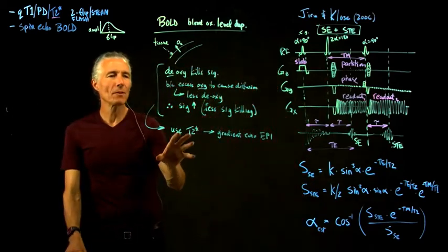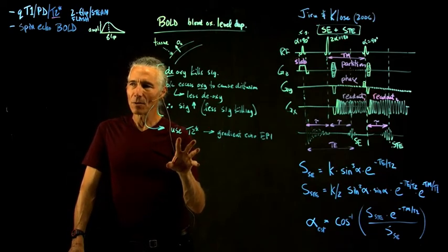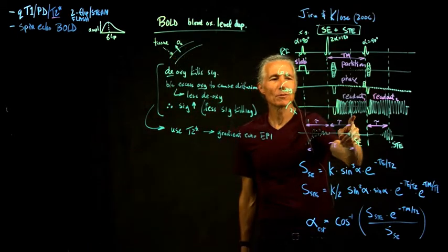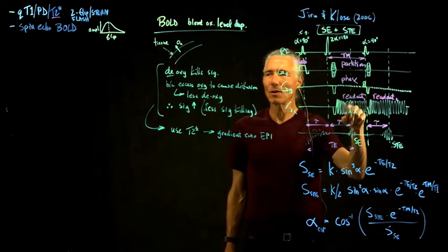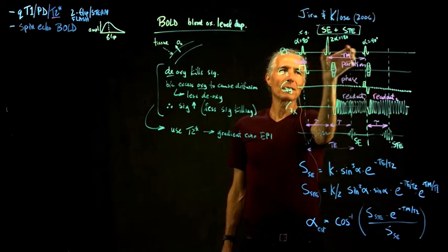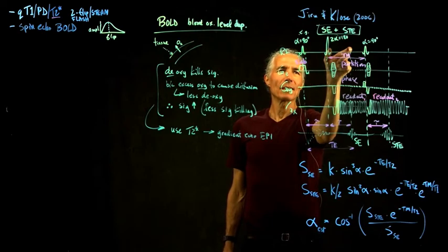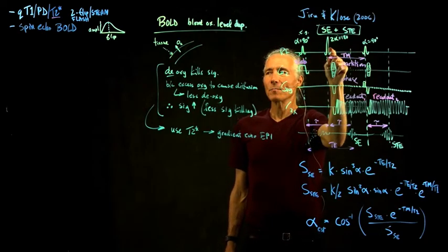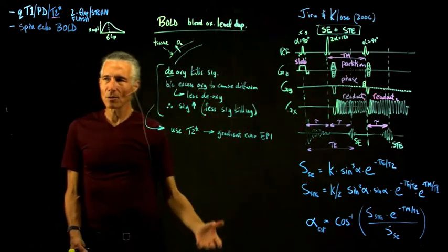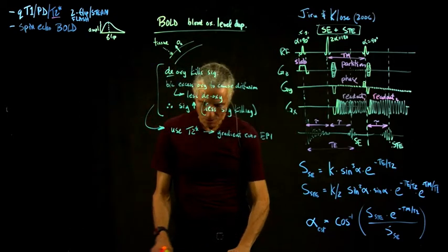The fact that this argument is approximately correct is shown by doing a spin echo scan. So if you do this kind of a scan where it's an EPI scan, which is almost all gradient echo, except that the center of K-space is a spin echo because you collected the center of K-space essentially the same amount of time after an inversion pulse, the BOLD signal goes away. So why on earth would you want to do that on purpose?